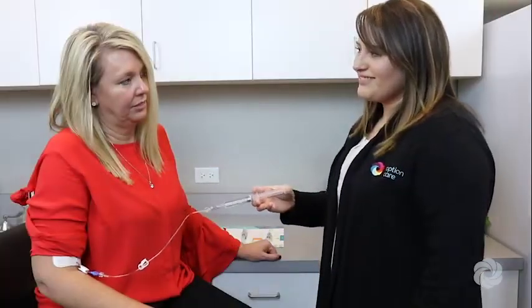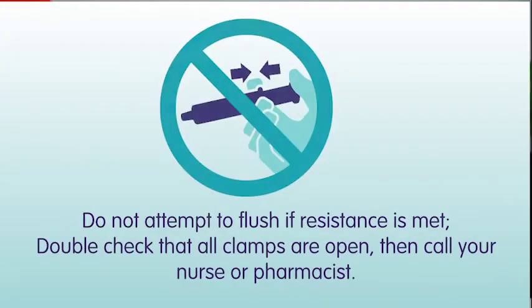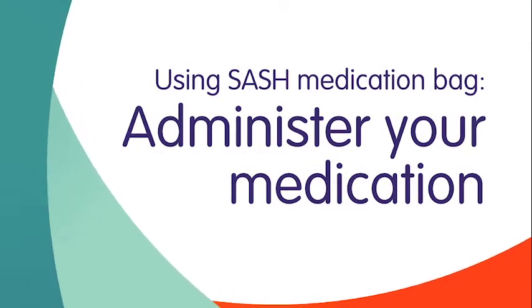Flush your IV catheter using a push-pause method. Do not attempt to flush if resistance is met. Double check that all clamps are open, then call your nurse or pharmacist. Lastly, remove and discard the saline flush syringe in a trash container.